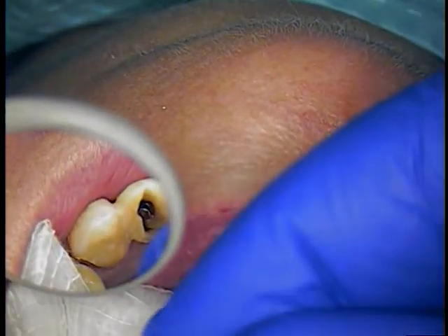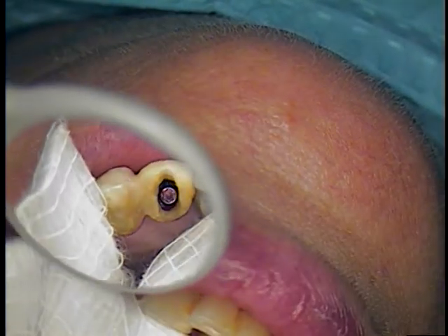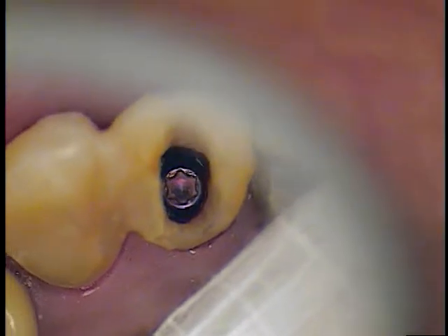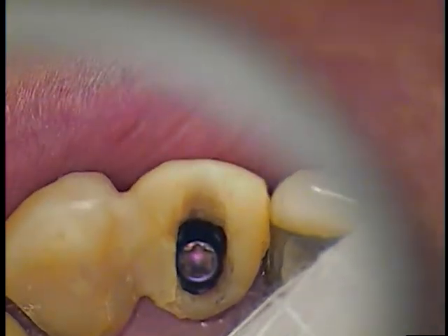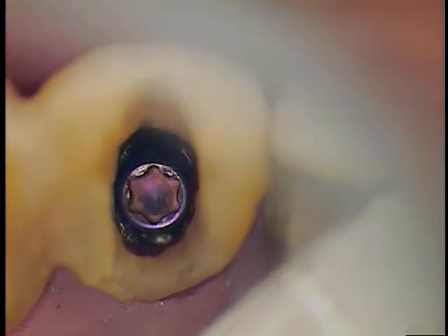Now our patient's going to be instructed not to really eat on this. All right, there's the new screw. Again, let's look at that close up. All right, so it's not buried in there. I'm not tightening it down with anything. It's just a screw that I'm going to place to keep that opening.